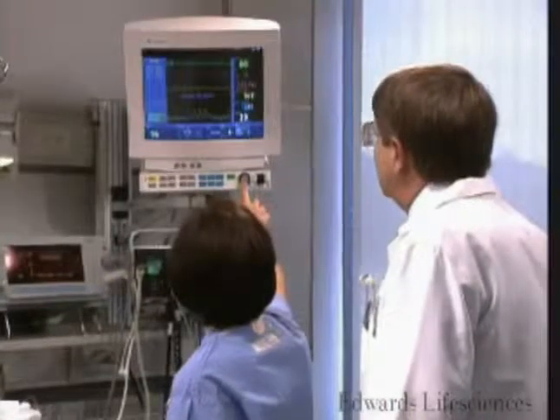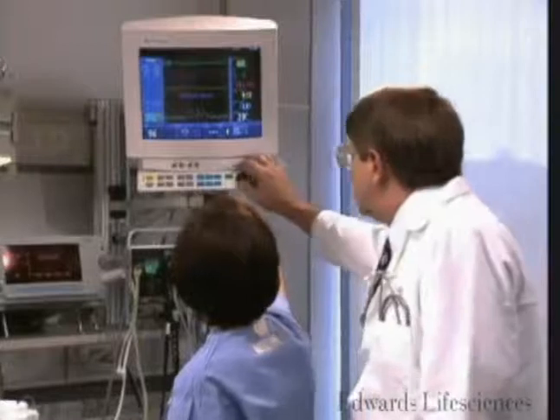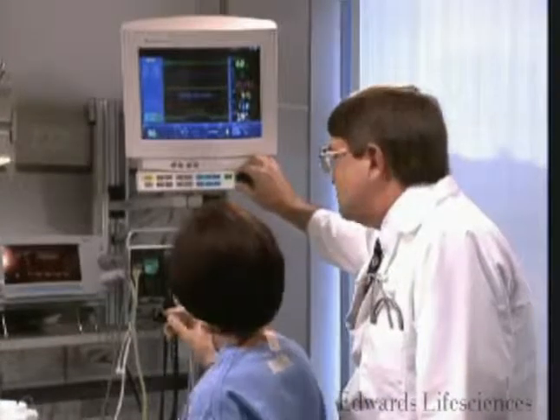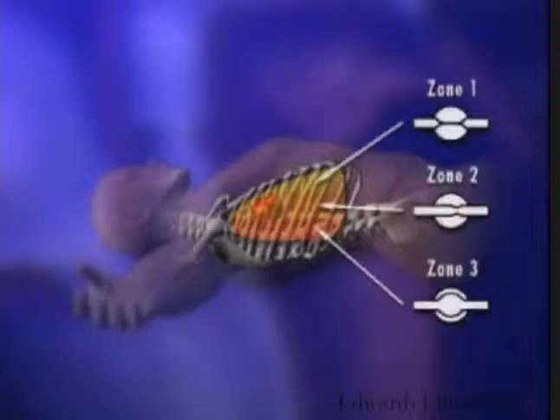Ideally, pulmonary artery and wedge pressures should be obtained when the tip of the pulmonary artery catheter is positioned below the level of the left atrium. This is referred to as West Lung Zone 3, in which both arterial and venous pressures are greater than alveolar pressure.